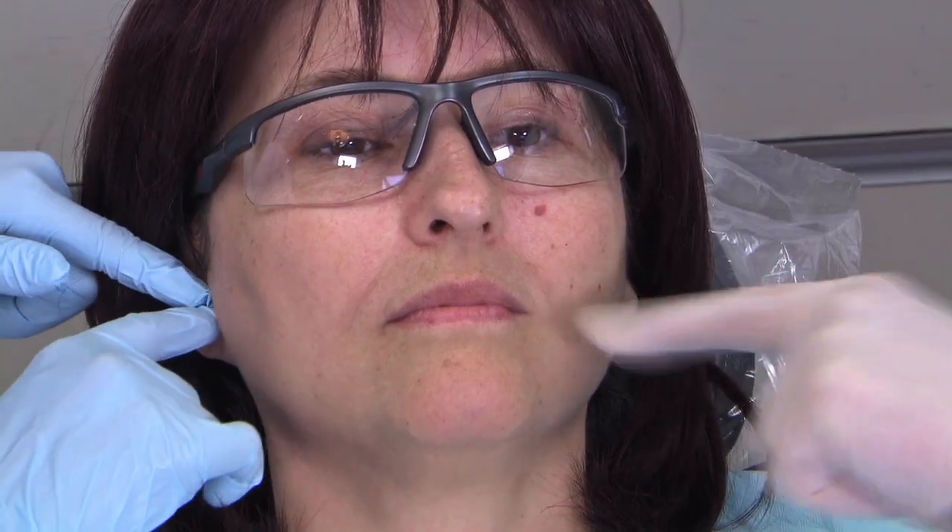Well, first off is just switching our thinking from the parallel-to-occlusal-table approach that we think of for the IA, and defining what's going to be your upward inclination. The area we're looking at is from the corner of her mouth to her tragus notch. Just hold the mirror up there and kind of imprint that angle.